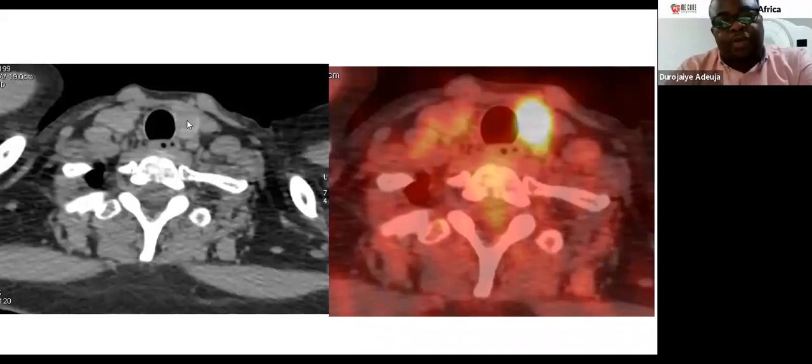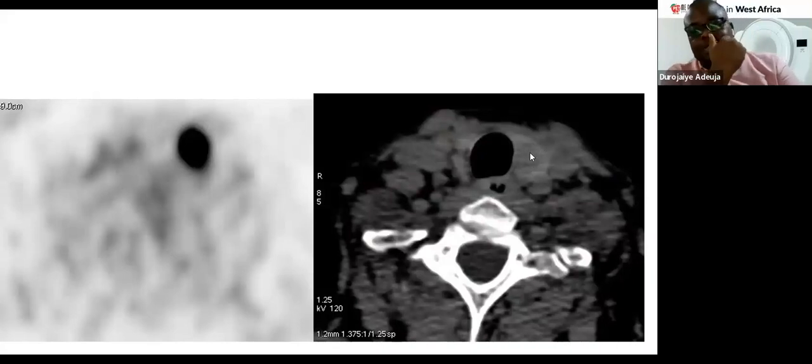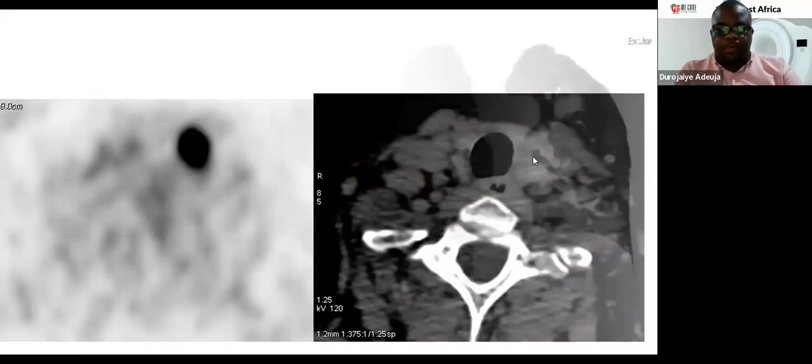And we were able to notify, sorry, not I now, but we, because it is the combination of the nuclear physician and the radiologist in reporting PET-CTs. So we were able to notify the referring physician, and we recommended an image-guided FNAC for this patient. This is just the PET image only, showing that area of increased uptake of the FDG, and this is the corresponding area on the contrast CT image at the level of the left thyroid lobe.